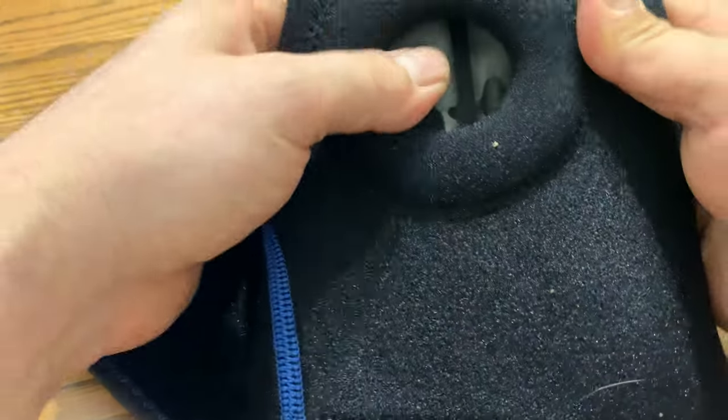Then you can wrap this — it's got a nice Velcro. Wrap that around your knee. It keeps it compressed nice and tight, or you can loosen it up if you want it loose.